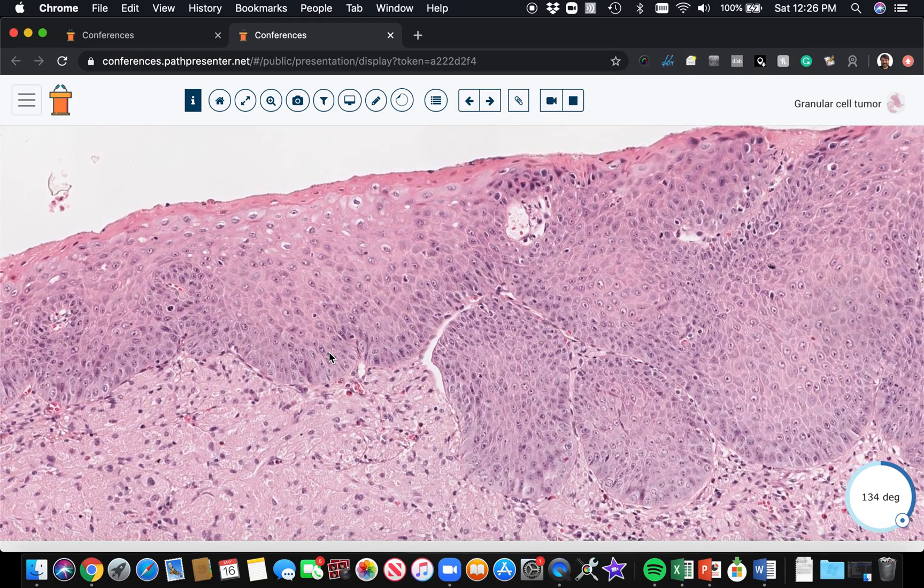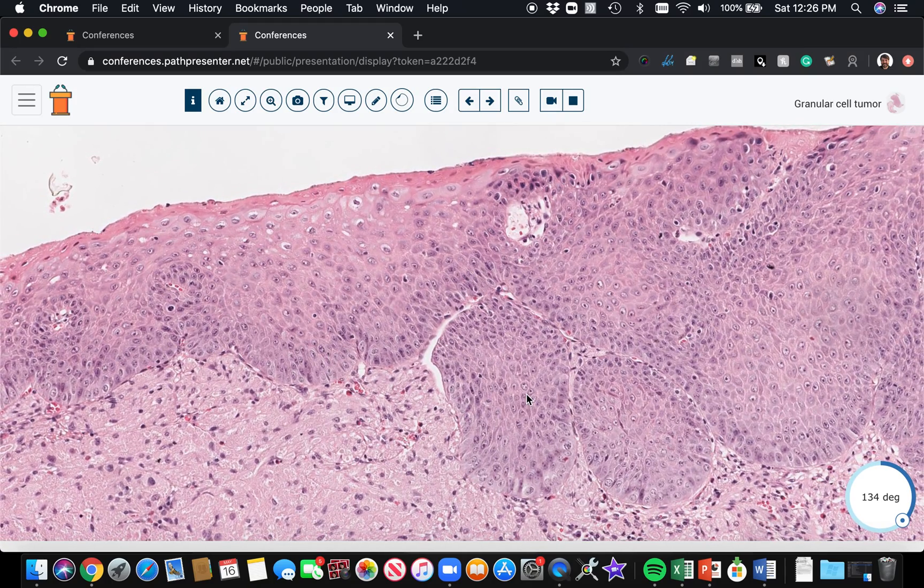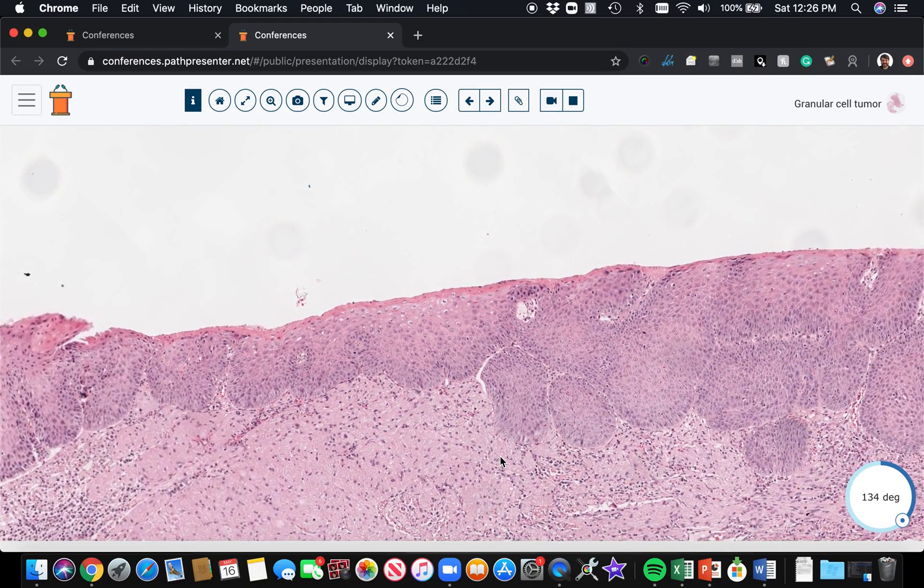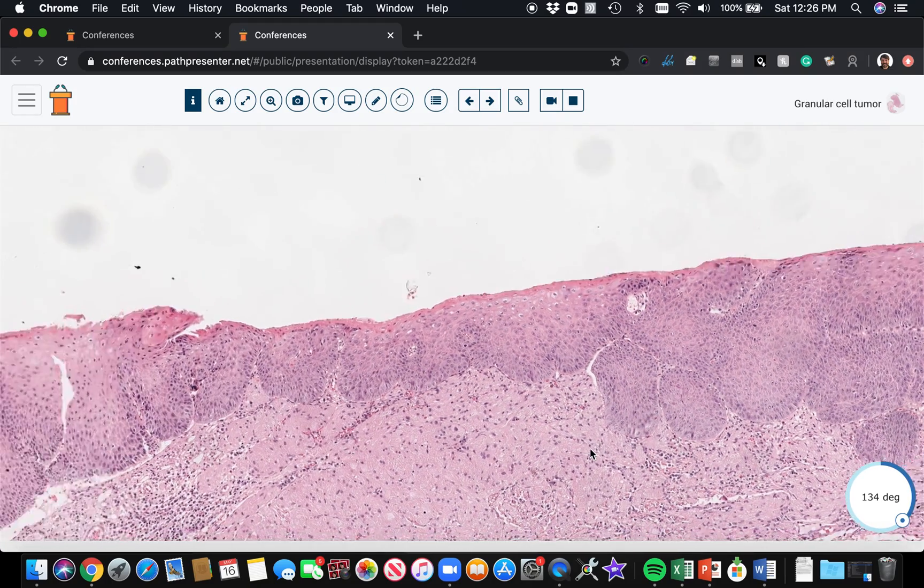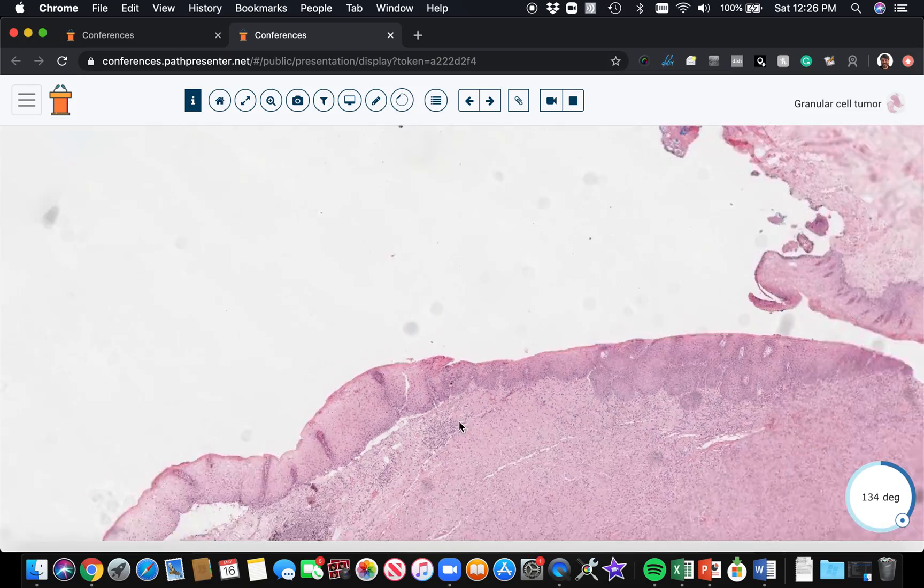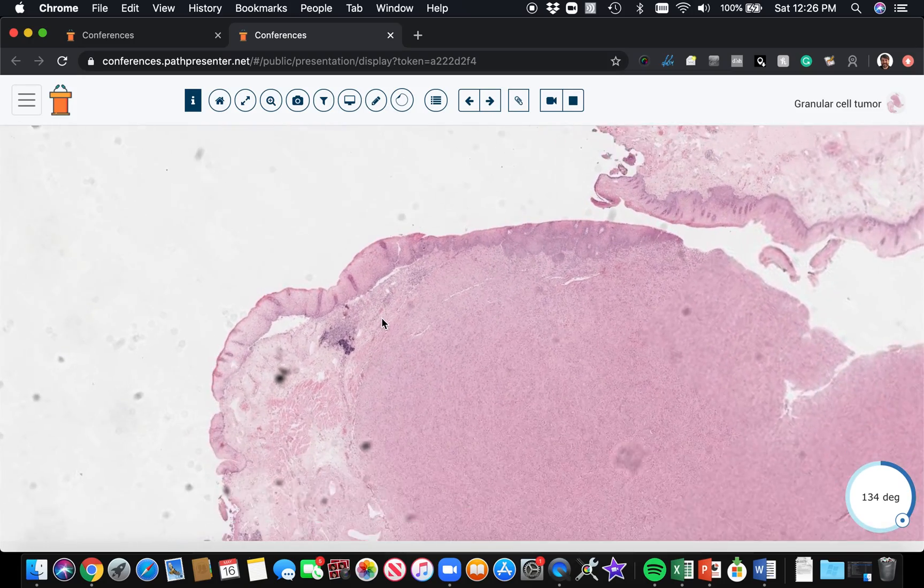Not every granular cell tumor does this, but it's an important phenomenon to know about. You don't want to make the mistake of calling it squamous cell carcinoma.